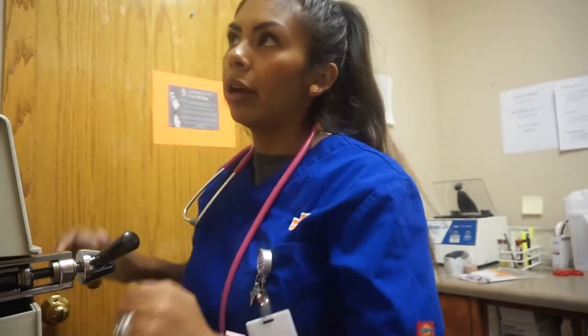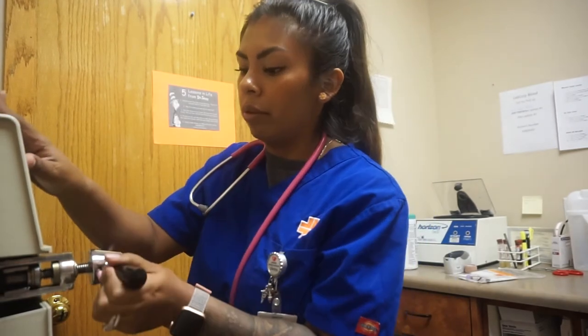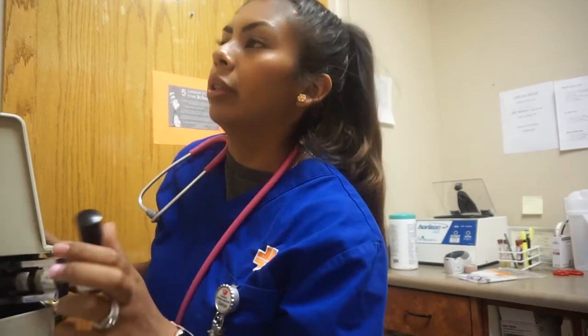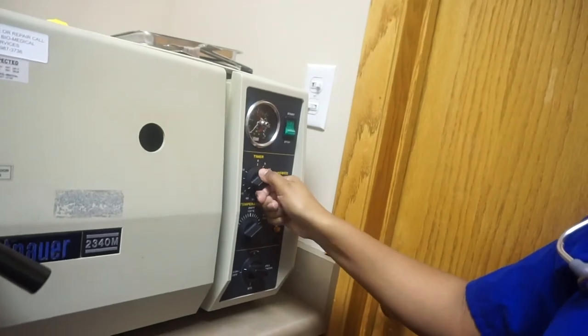So it already stopped for the steam cycle. I'm going to go ahead and open it up and release the extra steam — it's hot, so be careful. All the steam should already be out. I'm going to close it back up and leave it a little bit open, then switch to dry. I'm going to do 45 minutes on there too and leave the temperature the same. After it's done it'll ding, and once I'm done I can just set my rack on top and my autoclaving is all done.